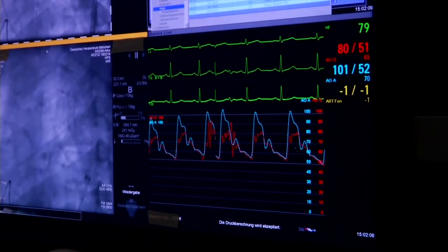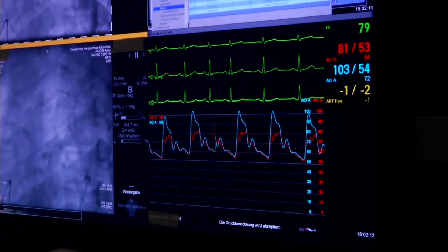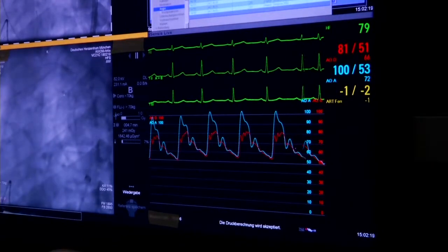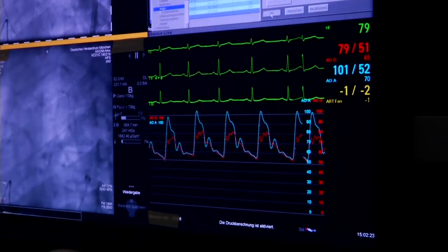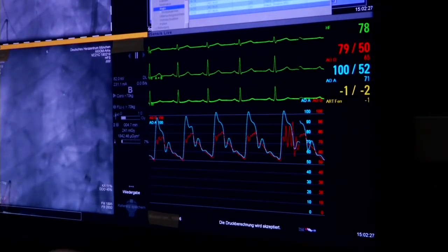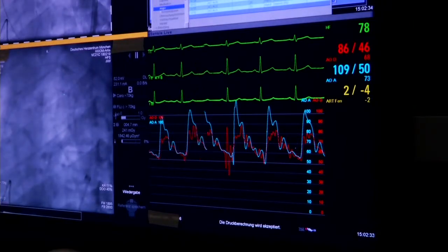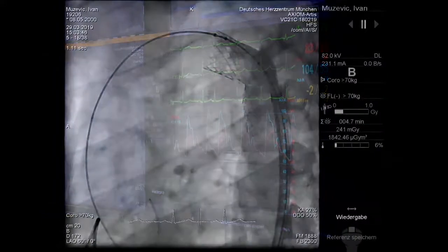I think what I do is I take an end-open catheter and try to find out where this major gradient occurs, whether it's at the proximal part of the arch or perhaps at the entrance of the first stent. Can I get a multi-purpose and a wire? On the way. And first of all, we do an angiography, perhaps once again. Or do we have enough? Let me see how the hand injection was.